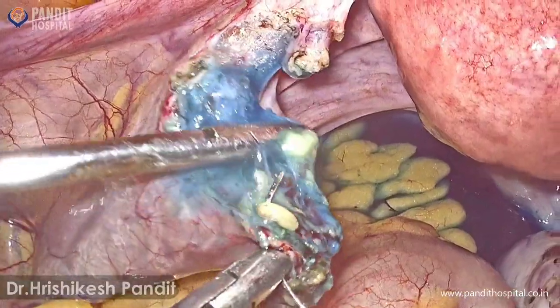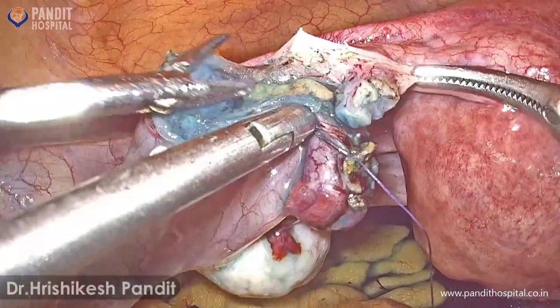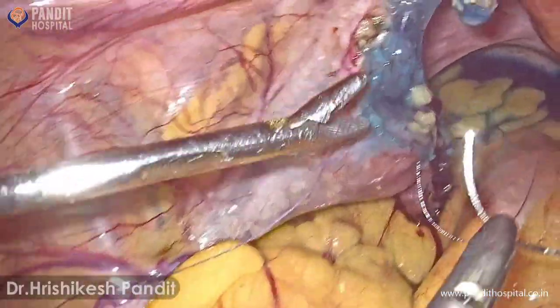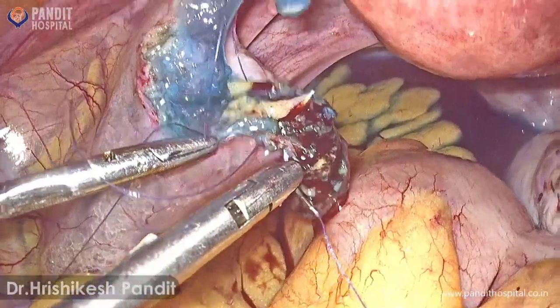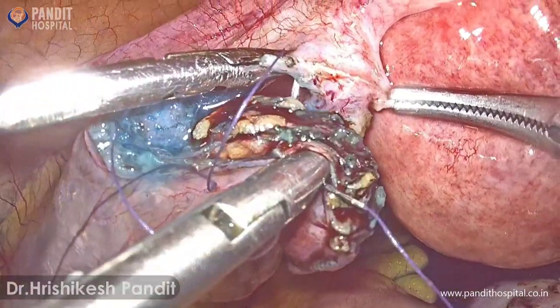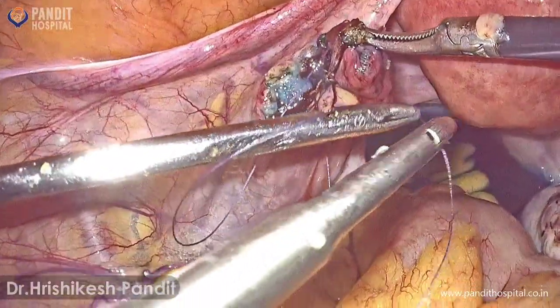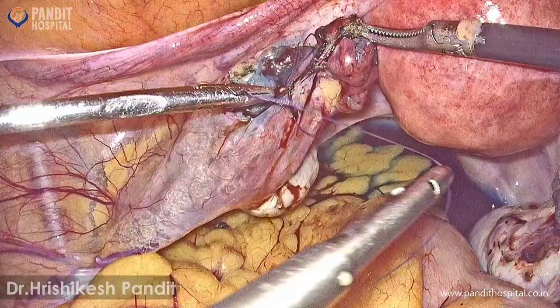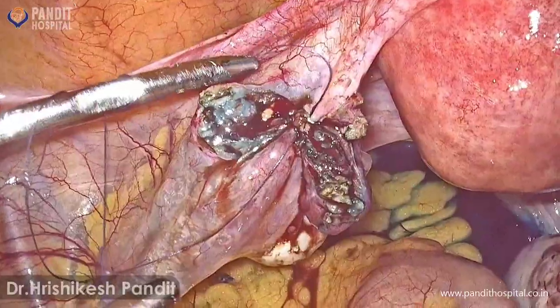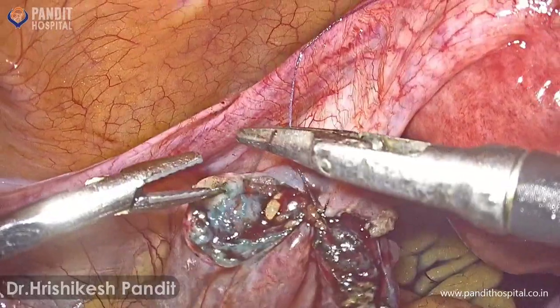The intention of checking patency is to verify the passage as well as to stain the mucosa so that we can stitch it properly through the lumen. Again, the first stitch is at 6 o'clock through the mesosalpinx. This stay stitch will bring both ends together. This procedure really needs a lot of patience for anatomical correction, and precision is needed when putting the stitch at 6 o'clock and 9 o'clock to ensure proper anatomical positioning.